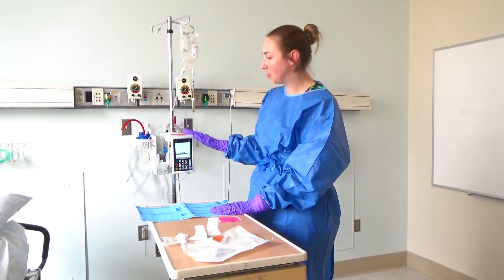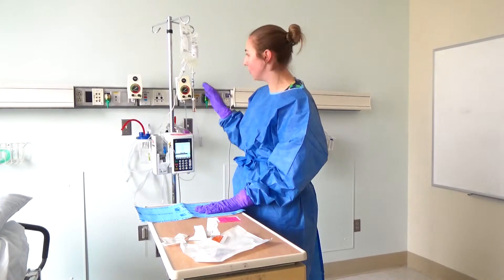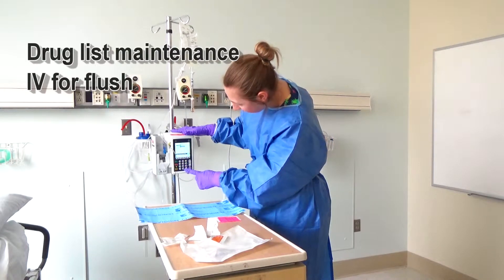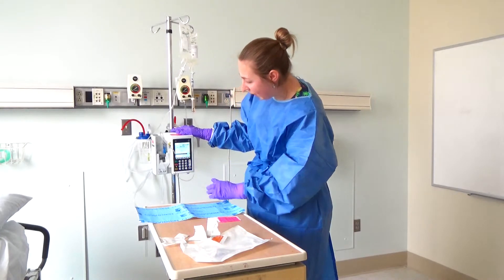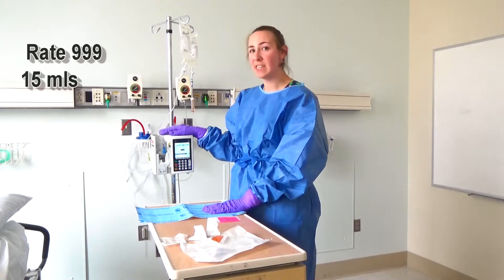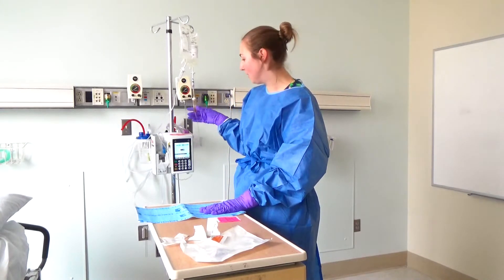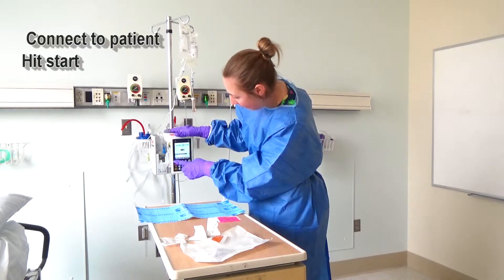The next step is to prime the line using the B channel to get all of the saline out, so when you start the chemotherapy it's at the tip of the tubing. To do that, I'm going to push B under the drug list. For the flush, I'm going to check maintenance IV. I'm going to go ahead and do 999 as my rate, but very importantly I'm only going to do 15 mLs, because I would not want to give chemotherapy at a rate of 999. 15 mLs will allow us to get the chemotherapy through the secondary piece and through the rest of the primary tubing. Then I'll go ahead and hit start.